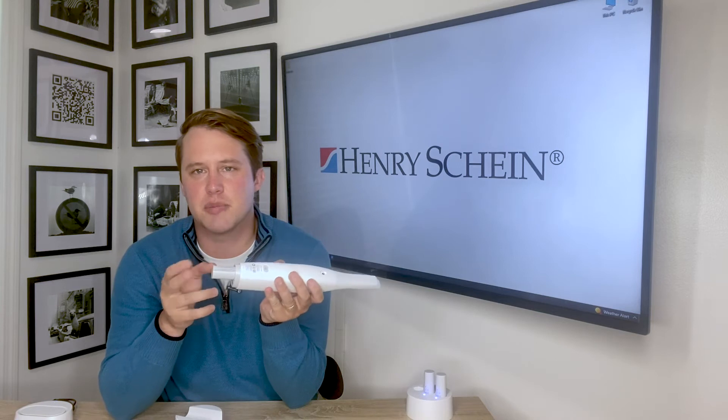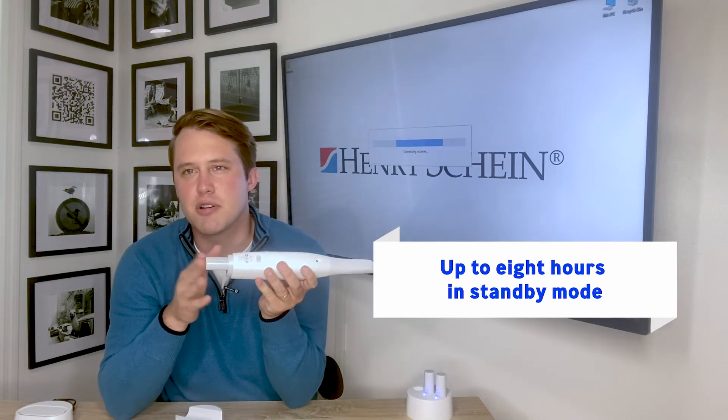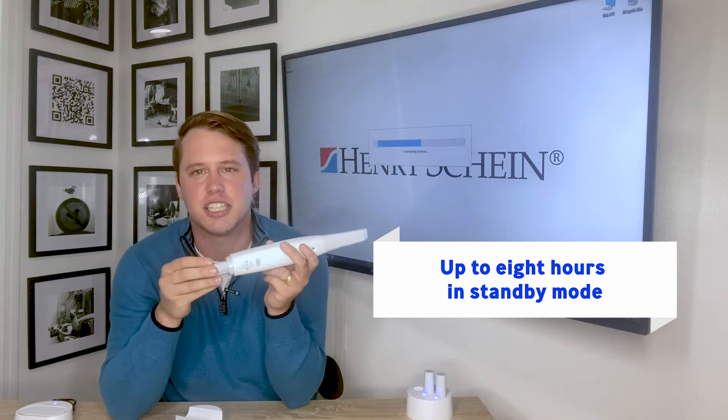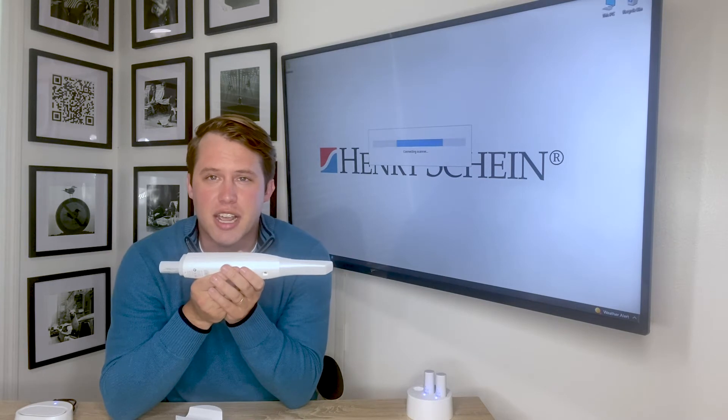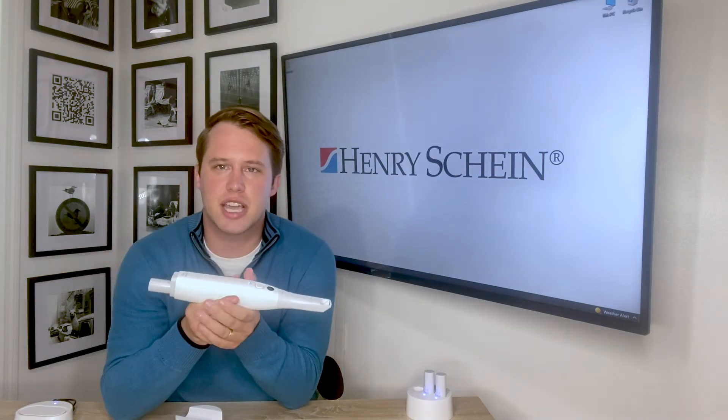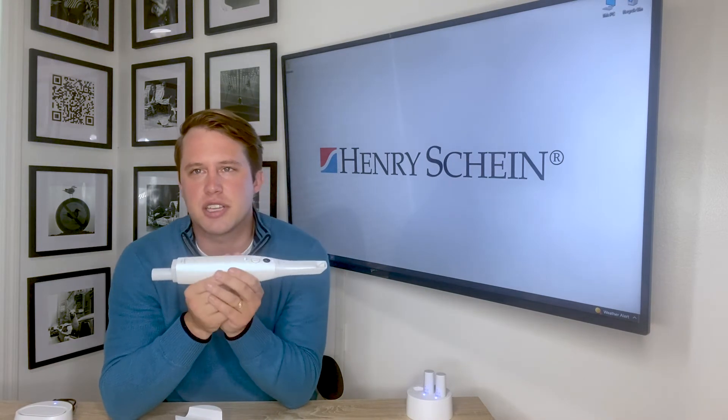Each battery also lasts about eight hours on standby mode. What I like most is that the intelligent power management technology enabled in the scanner immediately allows you to start scanning once it wakes up from standby mode — so you don't have to wait for the scan tip to heat up. You can start scanning right away.